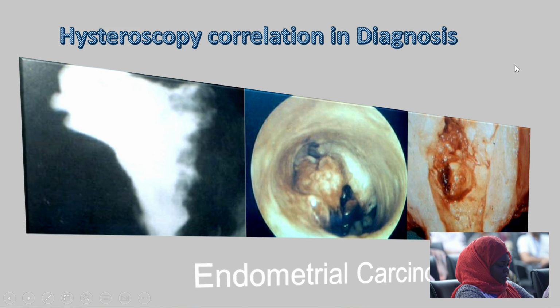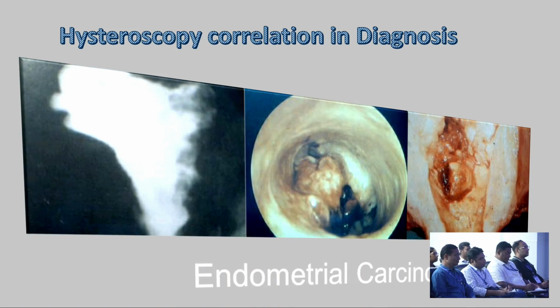If the tubal patency test shows it is open, it has 100% value. But if it shows that the tube is blocked, it has only 80% value. The tube may still be open. Then you have to do chromotubation. Chromotubation means the catheter should be introduced into the tube and then the dye injected into the tube, every tube, both tubes separately. If that shows the tube is blocked, then it should be considered as a block. Got it? So, hysteroscopy is necessary to do that.